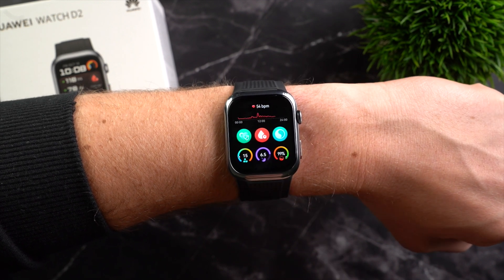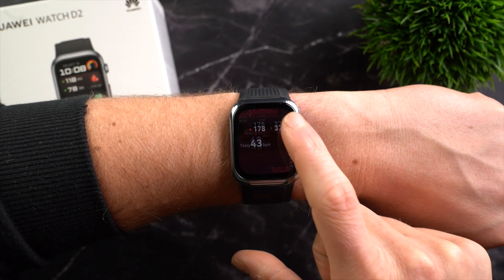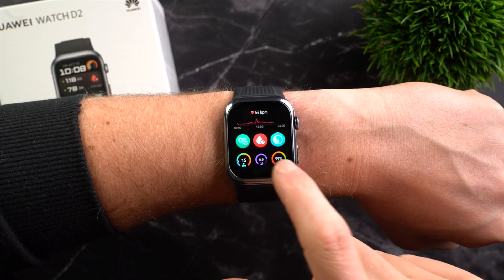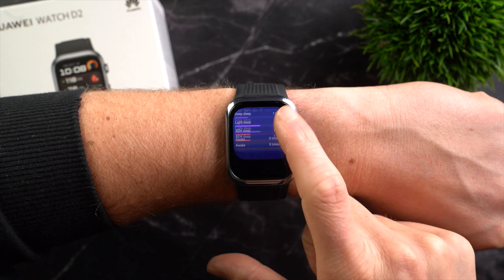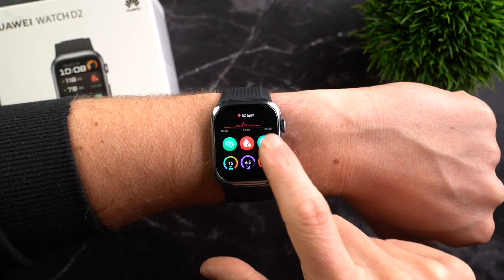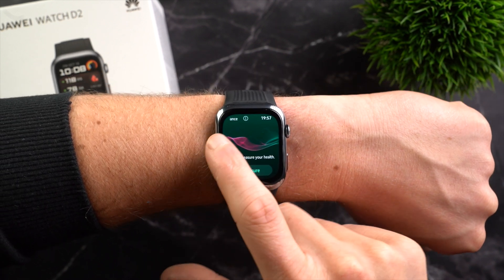There is a health overview where you can see important health data at a glance, including the heart rate trend at the top. Below, there are tiles for stress levels, blood oxygen saturation (SpO2), and sleep. Regarding sleep, the watch displays sleep duration, quality, breakdown of sleep phases, as well as respiratory rate, heart rate, and blood oxygen saturation. There is also a tile for blood pressure, one for guided breathing exercises, and a health glance widget, which briefly checks all important health data in a simple 90-second test.